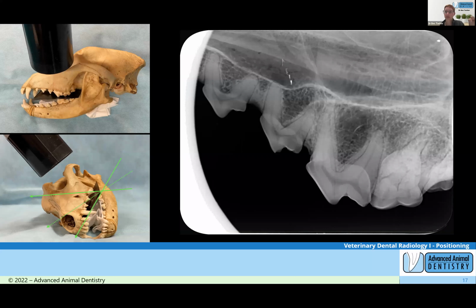If you look at the side of the image when it comes up, you'll have a bar on the side. It'll be red for underexposed. I think yellow is for suboptimal, or is it red for over? Can't remember, but green is what you want. Green will sit in the region where the image quality is good and the software isn't doing a lot to manipulate it for you, so you're getting a nice range of contrast.